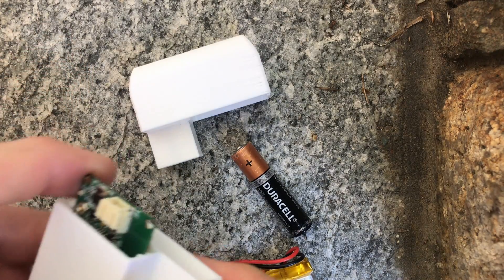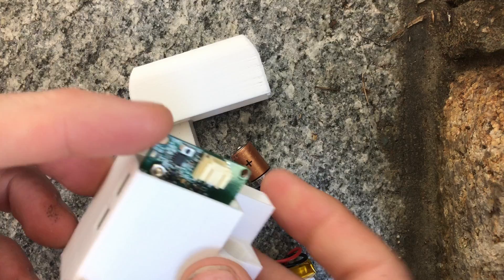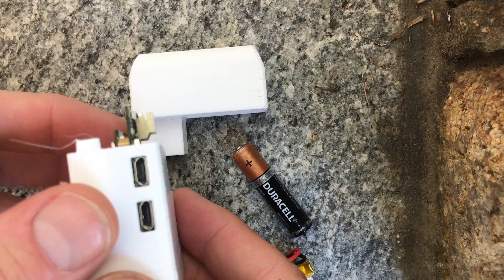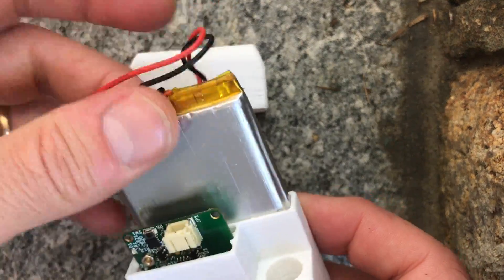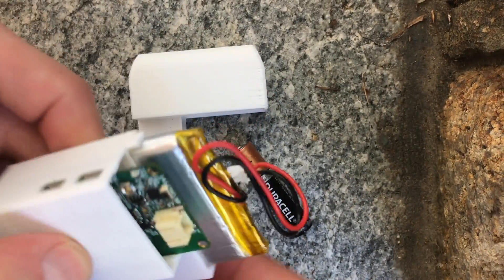This is a case designed for OpenAPS with the Explorer board. You can see that the two micro USB ports are accessible and there's an LED in there which shines through. It has room for the battery and that fits in securely so none of these parts will fall out.